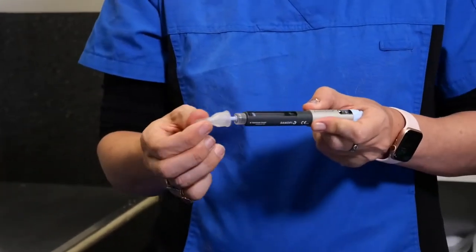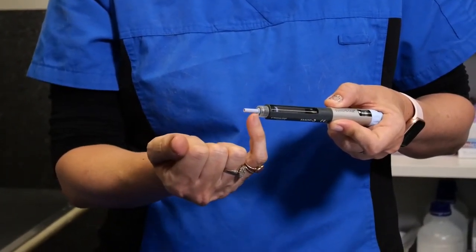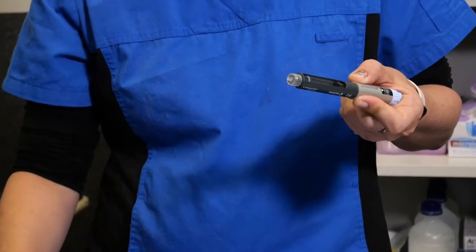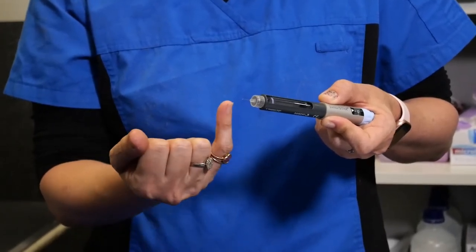Next, remove the plastic cap. It's also important to note that there's another protective cover on the needle, so this also needs to be removed. This is the sterile portion of the needle that you'll be using to inject under the skin.